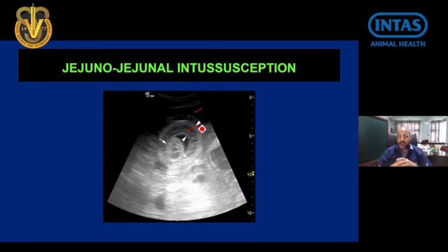It is no doubt a very beautiful modality to even do post-operative monitoring. When I operate a colic, I always tell them to do the scanning of the abdomen for at least 3 days to see whether the fluid is going off, whether the thickening of the wall is coming to normal, that the fibrin is not there, and that the peristaltic movement and the contracture of the organs have started. So post-operative use of sonography is also very, very important.